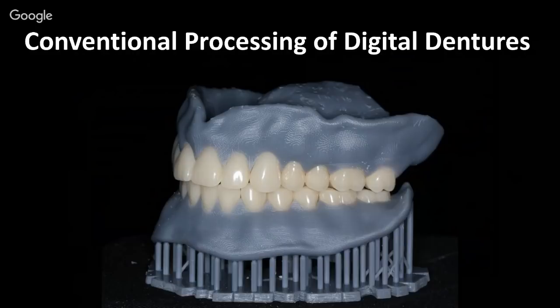However, I think this is incredibly valuable for the lab to pick up and to do this same workflow, because again, what are they spending all their time doing? It's grinding on these teeth and setting them in wax. It's just a very slow and inefficient process. So imagine how much they can speed their whole workflow up if they do that process digitally, or the doctor if they wanted to do it in-house.